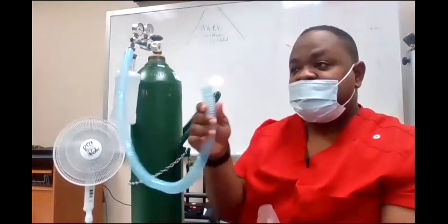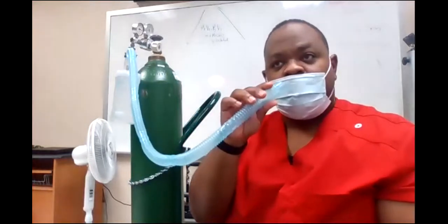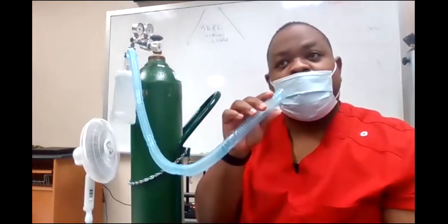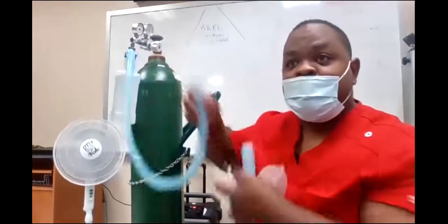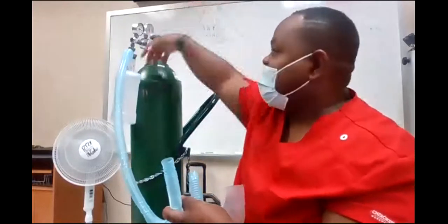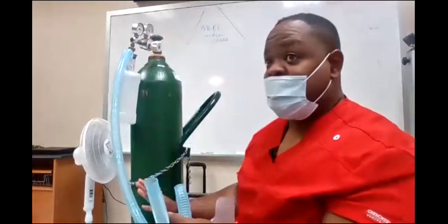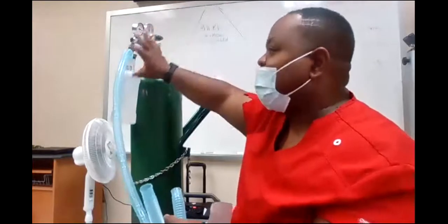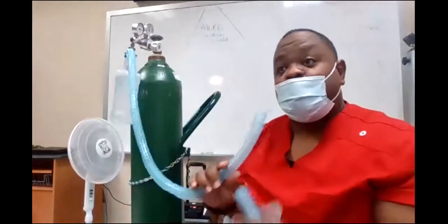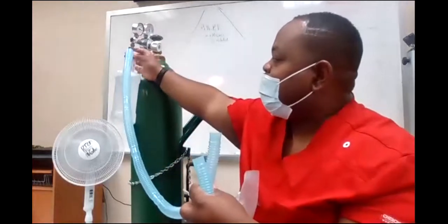And this is it right here. This is 15 liters per minute of 40% oxygen coming out of here. And it's nice and cool and moist, okay? This is pure oxygen, but it's been bled in, see? And outside air is entraining into these windows right here, right? So now this should be 100%, but since I have the windows open, outside air is coming in and bleeding the percentage down to what I said, which is 40%, okay? If I want them on 100%, I close the windows.